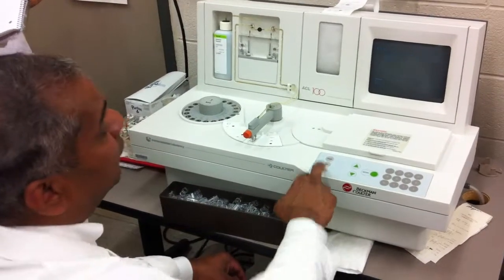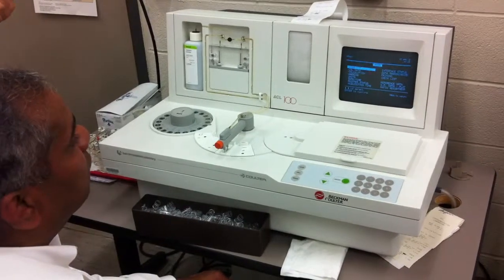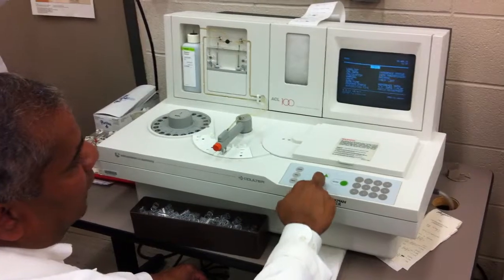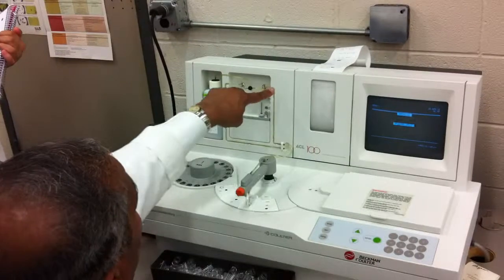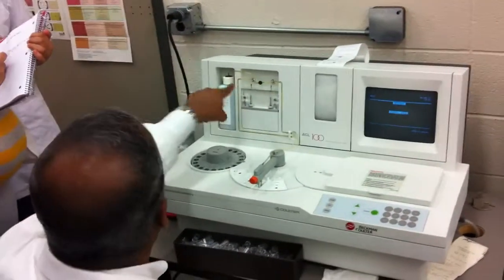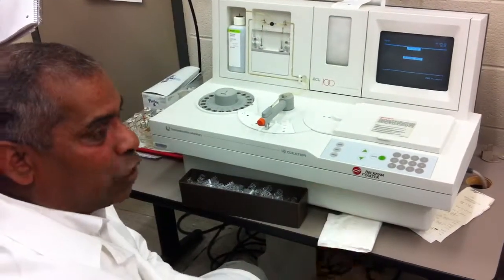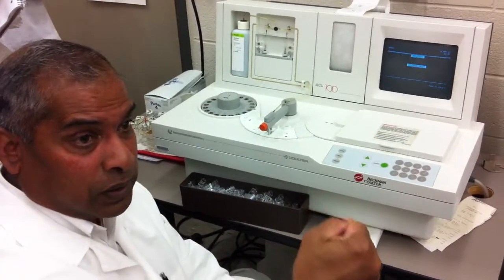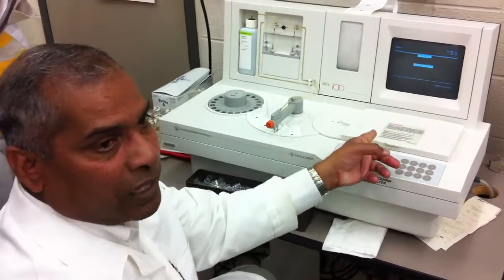Okay, another thing that's in program that you always use is the priming. All you have to do is use the arrow, go down to priming, see that? And you press enter. What it's going to do is prime all these lines, and the reason for priming is very simple, to remove air bubbles, okay? Because there's a pump, you see this is working, that allows the probe to take up and deliver specimen and reagents into the carousel for the testing.